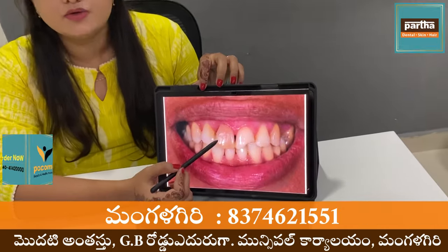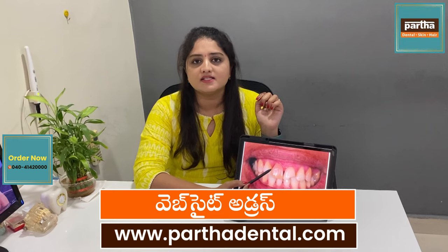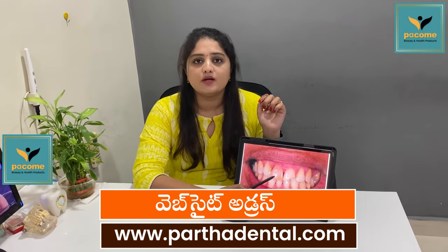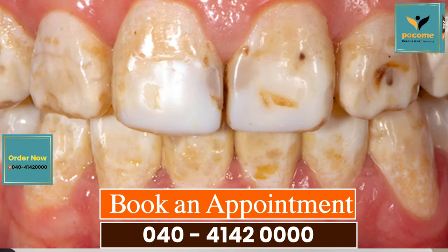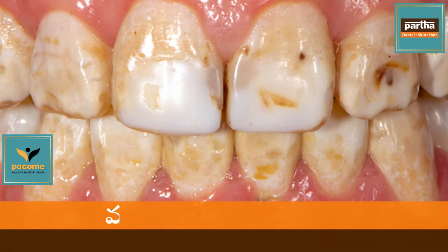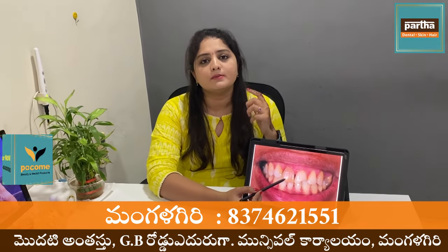This is the way you can take an x-ray. You can use a cap. This case has a little bit of fluoride water. In certain cases, it has a nice brownish color. You can mask the teeth with composite cement.